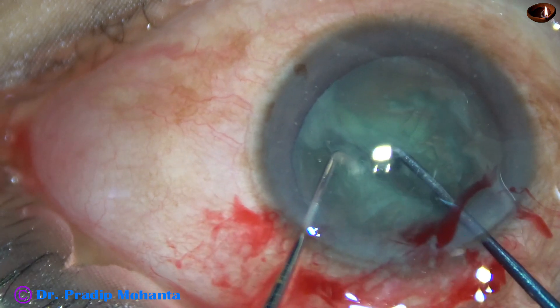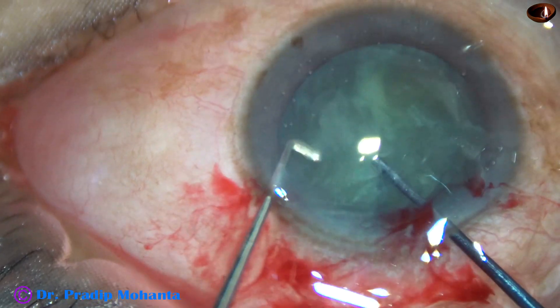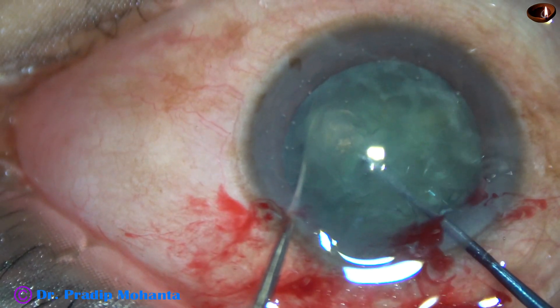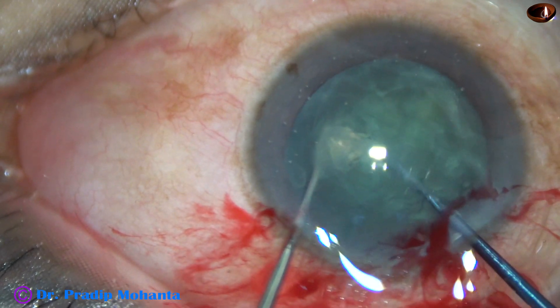Here it is. By opposite forces, the nucleus is completely divided into two hemi-nuclei. The nucleus is rotated and one hemi-nucleus is pre-chopped into two pieces.